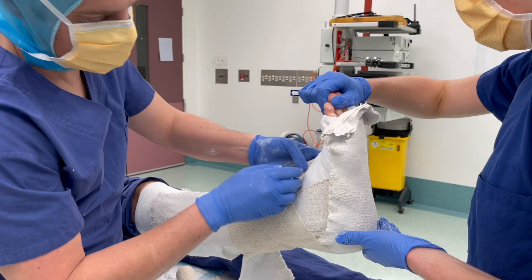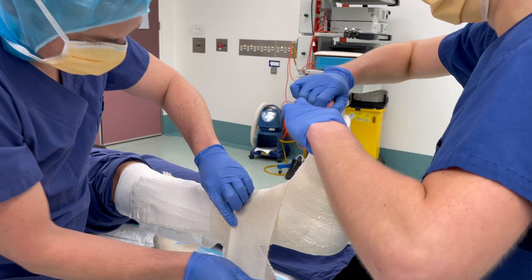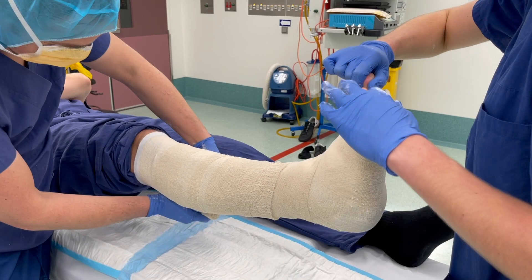There should be two crepes close by. Starting with the 10cm crepe, wrapping from the ankle and travelling distally. At this point any excessive plaster can be folded back with the crepe. Next we complete the rest of the leg with the 15cm crepe.